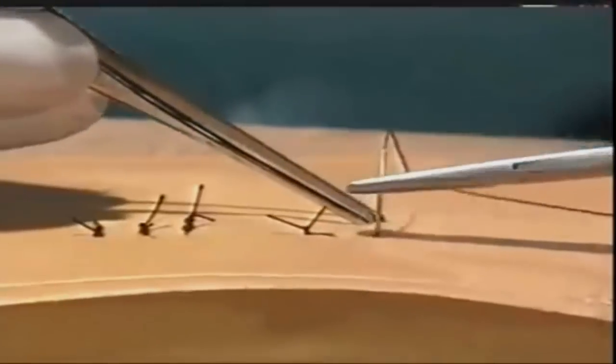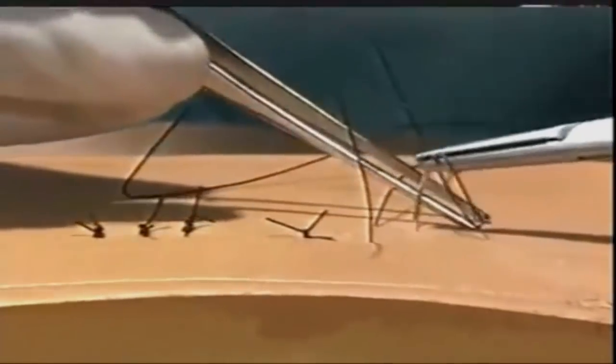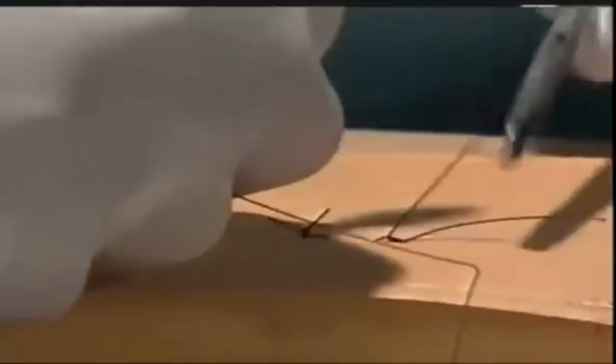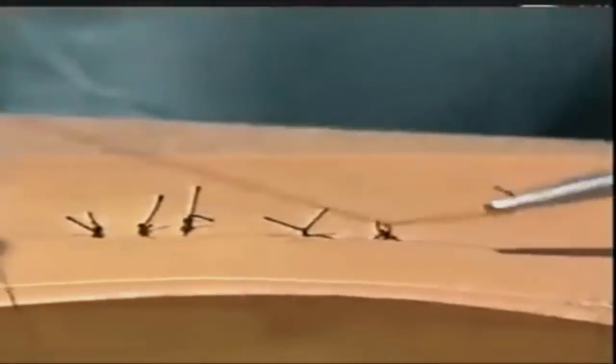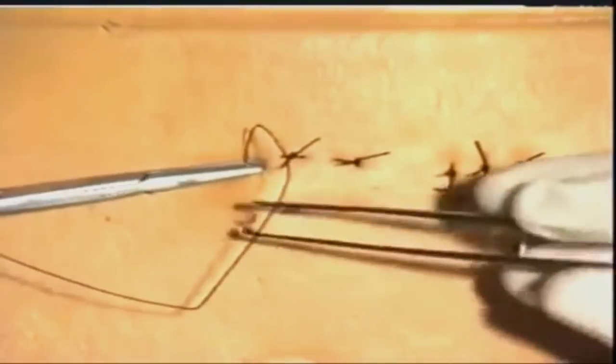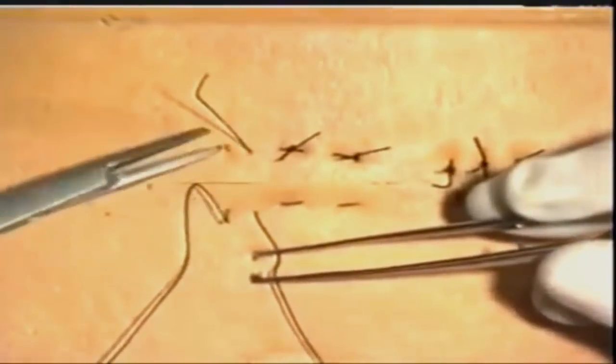We will now insert another horizontal mattress suture. The suture is inserted in the standard manner, the needle reversed, and then returned to the opposite side of the wound parallel to the initial traverse. The suture is then secured with a reef knot. Both vertical and horizontal mattress sutures can be useful for ensuring eversion or inversion of wound edges, and this is clearly demonstrated by diagrams in your handbook. The difference between the two can easily be seen in this demonstration.